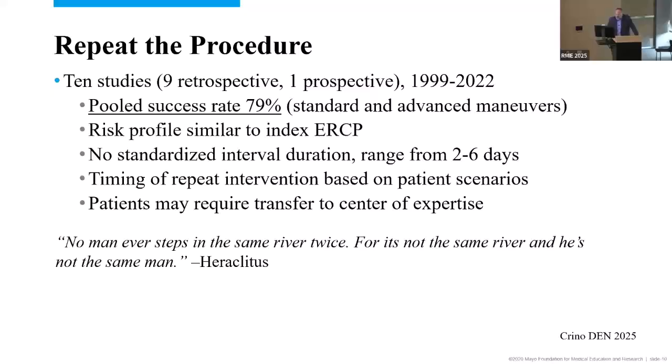And I think that applies to this in the sense that very often, when the patient comes back the second time, number one, if it's a patient who was initially done at your center, you know what didn't work the first time. You know what you did the first time, and you can make adjustments based on that. And then in terms of the patient, now the patient no longer has an edematous papilla, no longer has any trauma from your prior attempt, and your chances of getting into the bile duct are exceptionally high.